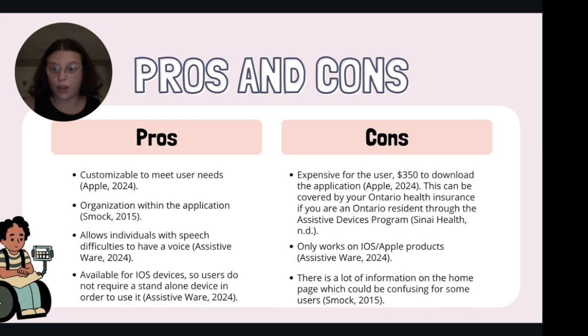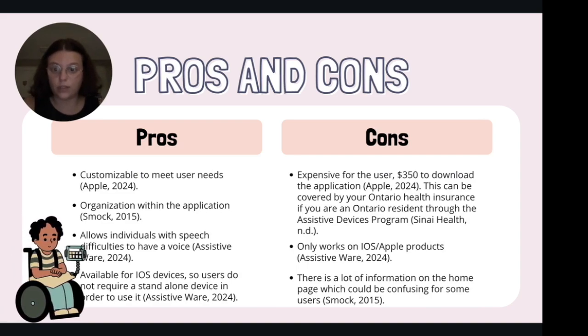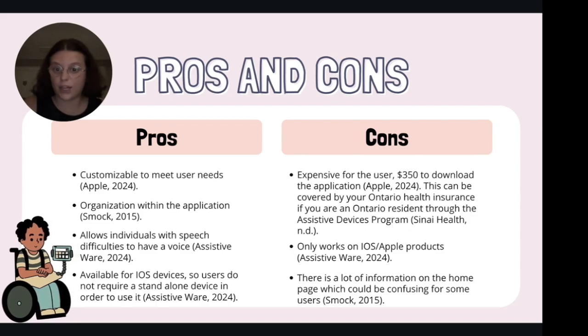Now, there are many pros and cons associated with using this application. Some of the pros include that it is customizable to meet user needs. Another is that the application is well organized with categories and labels. This application allows individuals with speech difficulties to have a voice, and it is available for iOS devices, so users do not require a standalone device in order to use it.